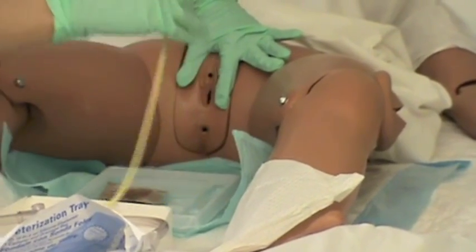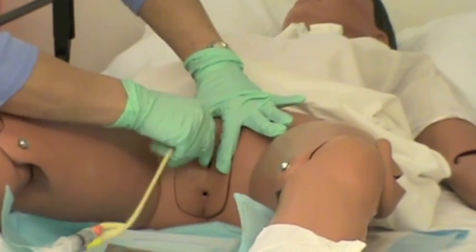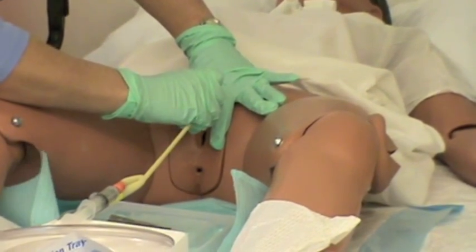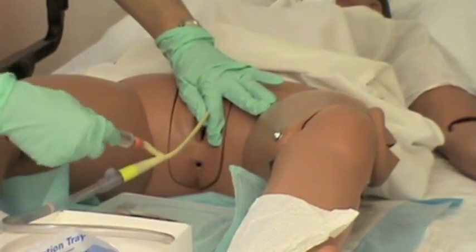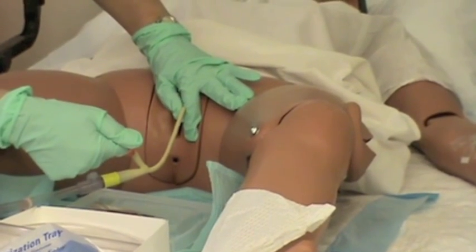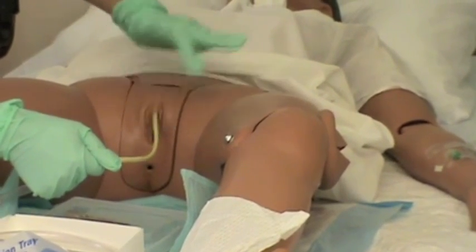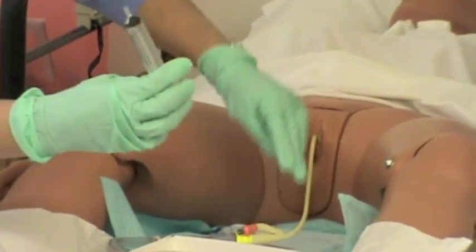I'm going to take the catheter and advance. I'm looking for yellow urine return — and I see urine in the tube. I'm going to advance it two more inches. Grasp it with my non-dominant hand and hold it steady. How are you doing? Any pressure? Any pain? It's uncomfortable but I don't feel any pain. Great, you're almost done. Inflate the balloon, let go of the catheter and take off the syringe. The syringe will go into sharps.